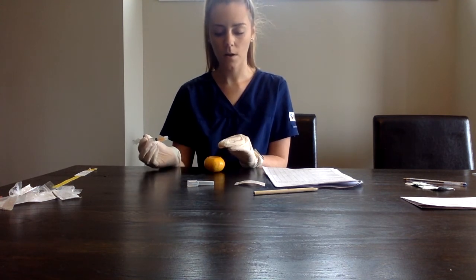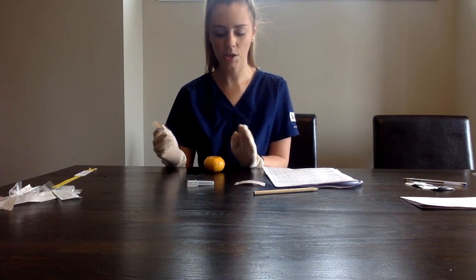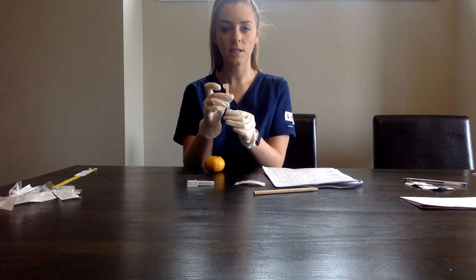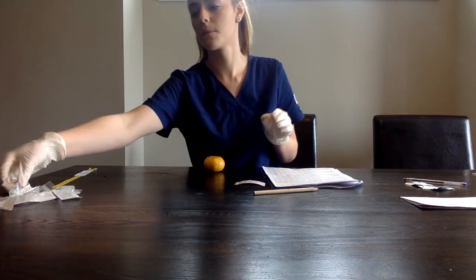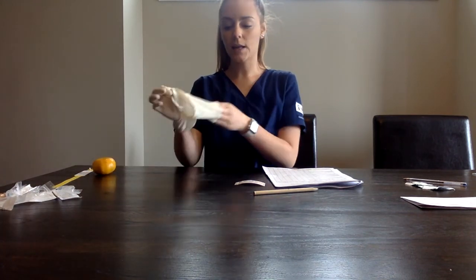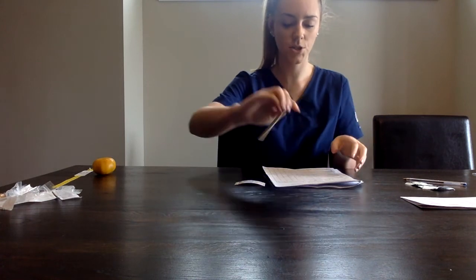We'll put a cotton ball on that injection site, making sure we're not massaging the area, just keeping that cotton ball just right on that injection site. We can activate the safety mechanism, and this can go into the sharps container. And then I can remove my gloves, we'll put them into the garbage, and I'll do hand hygiene. And then I want to document that I did give this drug to Jake.